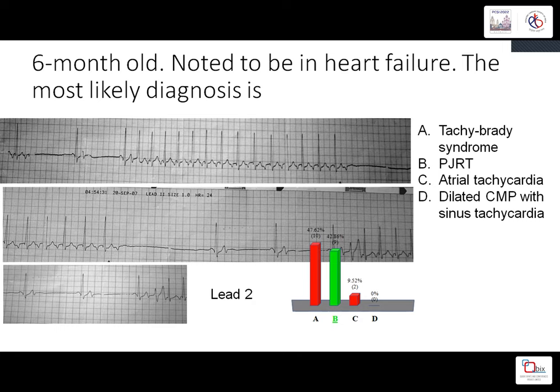What is the treatment? You said it: ablation. When we interrogate an arrhythmia, we use the terms long RP tachycardia and short RP tachycardia. So it's a long RP tachycardia, isn't it? See, RP is long, and you have an inverted P wave before the QRS. So we tend to diagnose ectopic atrial tachycardia, correct?